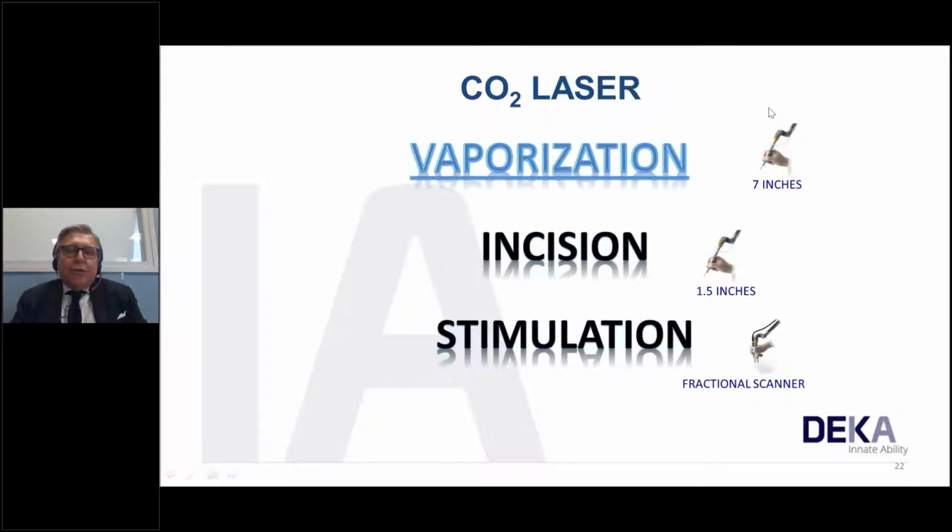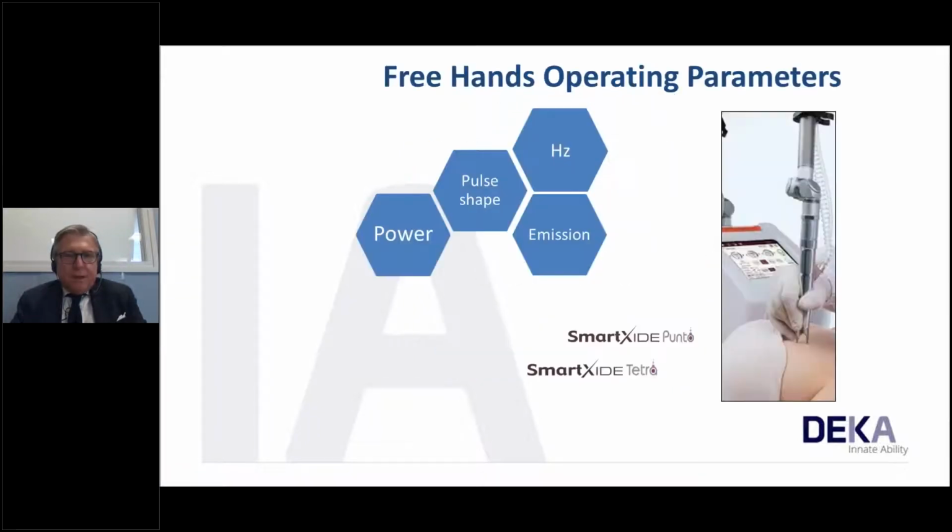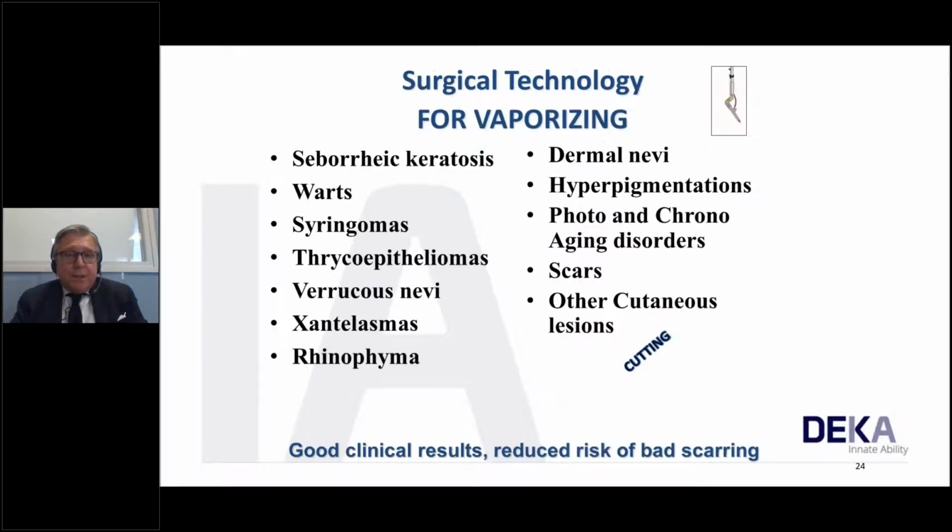And even the action on the skin: we can have vaporization, incision, and stimulation with the fractional scanner. With the freehand operated parameters, you can pay attention to the power, pulse shape, frequency expressed in hertz, and emission. We can do this with all the models and platforms.